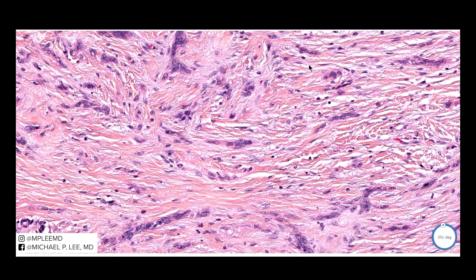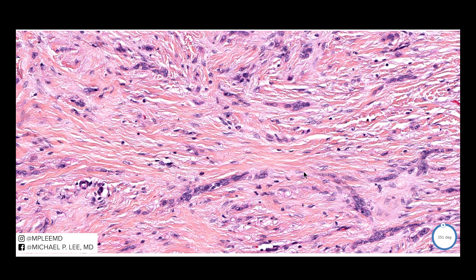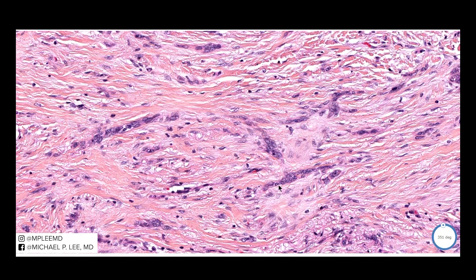Differentiating this from a trichoepithelialoma — if you remember from the tricho-ep from Wednesday, we saw, first of all, the horn pseudocysts with the calcifications. And in the desmoplastic cord-like growth pattern, it was usually a little wider than this. Oftentimes it had that sort of fibrostroma, which was CD34 positive. The fibrostroma would show clefting, similarly to what you would see in a regular trichoepithelialoma. But in this one, there's really not much clefting at all.